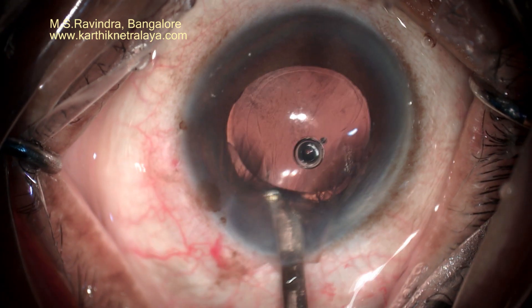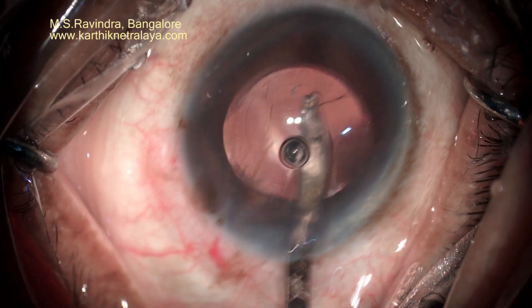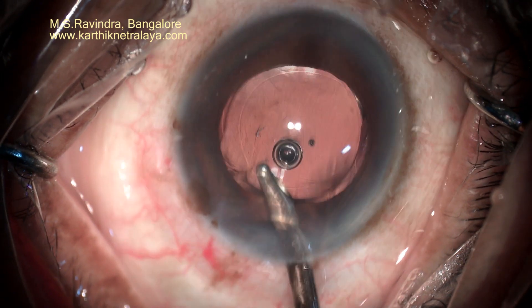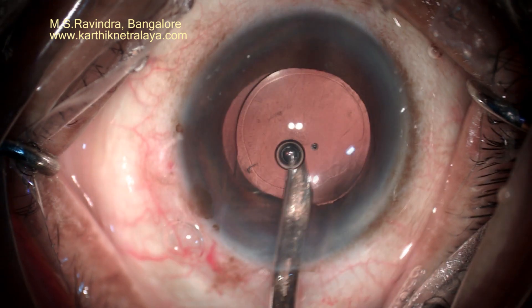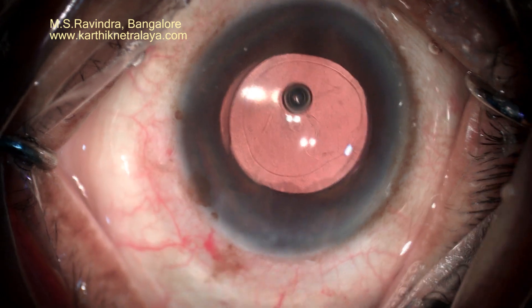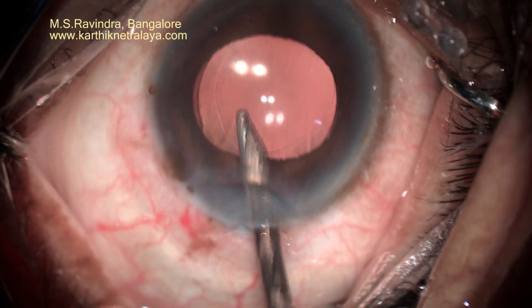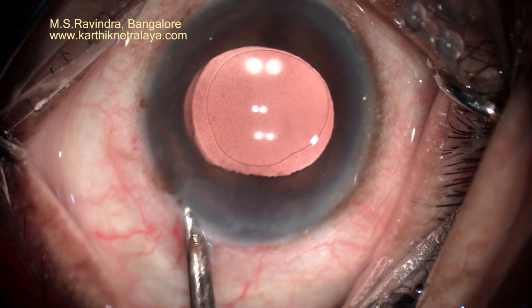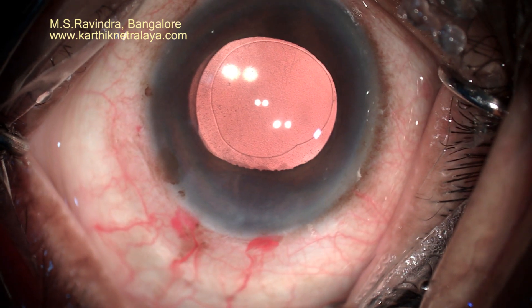The visco behind the lens in the capsular bag is completely aspirated and irrigated. The angle is irrigated to remove any pseudo-exfoliation material which may be stuck there blocking the angle region. All visco is removed from the anterior chamber, especially the material stuck on the back of the cornea, by reverse irrigation from the aspiration port.